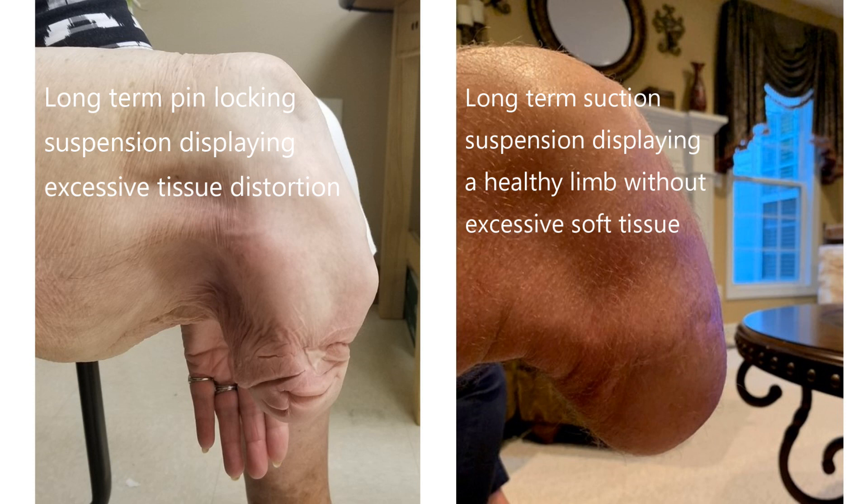Pin sockets can make great first prosthetic systems, but for patients who plan to walk for significant periods of time each day, a suction system is worth consideration.